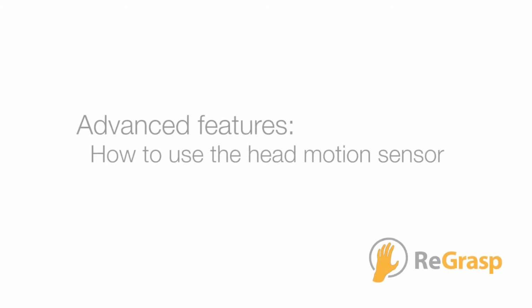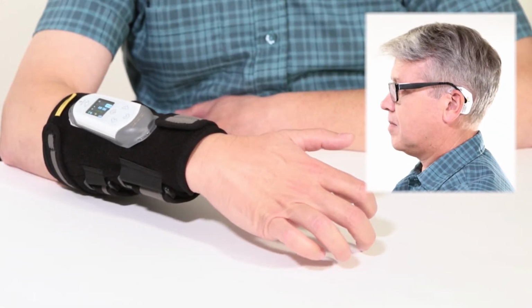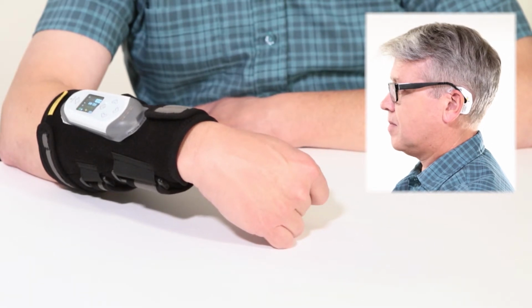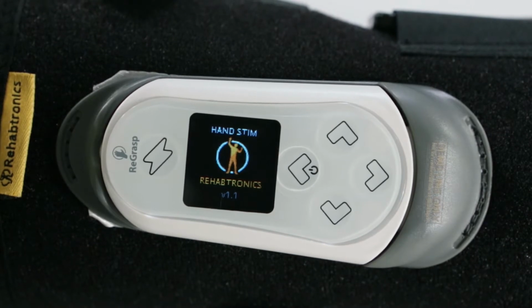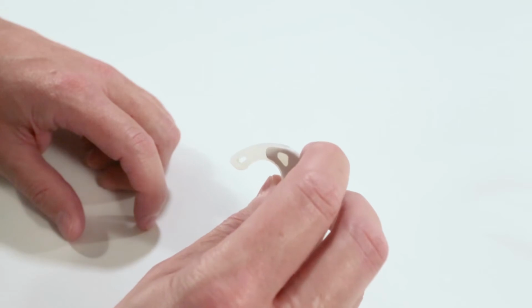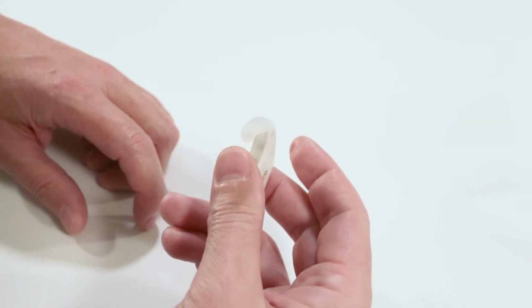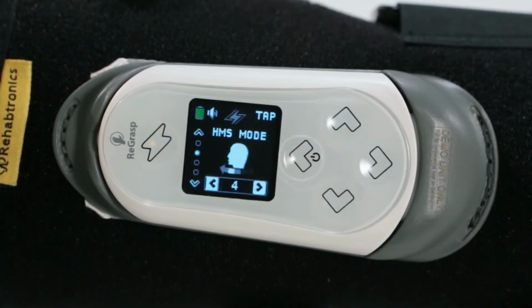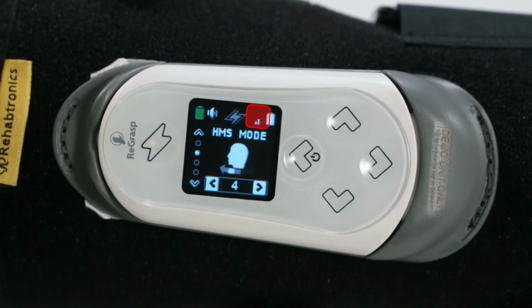In this video, we'll learn how to use the head motion sensor. The ReGrasp comes with a head motion sensor earpiece that can be used to control the stim unit grasping function of the ReGrasp. With the stim unit on, activate the head motion sensor by pressing the power button on the top of the earpiece. Once paired, the head motion sensor will show a green light, and the stim's screen will display a check mark as well as an antenna signal in the top corner of the screen.